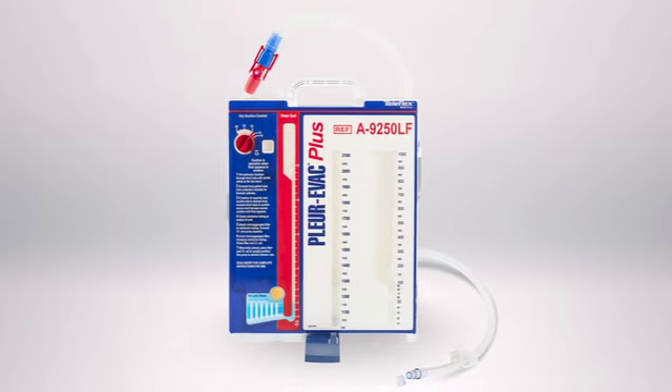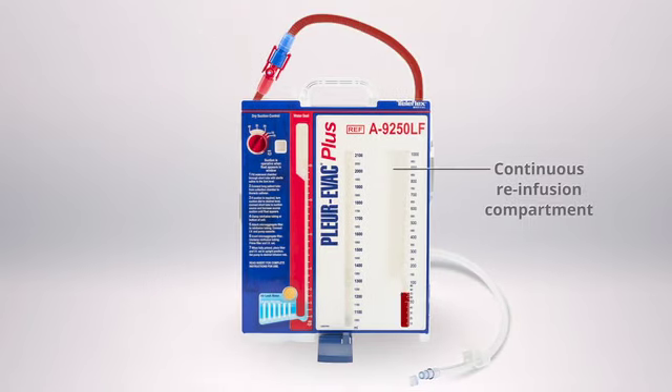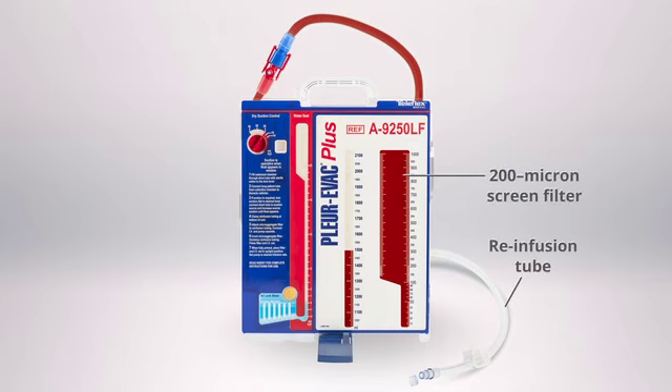The system has two separate compartments in the collection chamber: a large-capacity continuous re-infusion compartment and an overflow compartment. Contents within the overflow are not recoverable for re-infusion. The continuous re-infusion compartment contains a 200-micron screen filter and re-infusion tube extending from the back of the collection chamber.